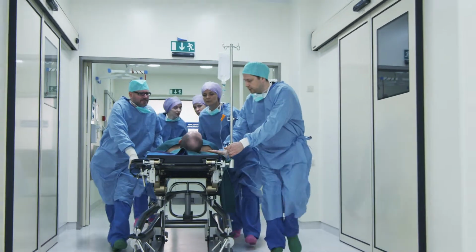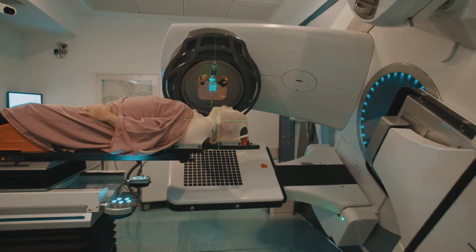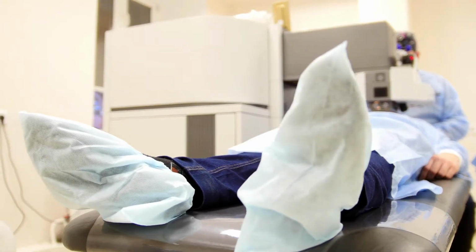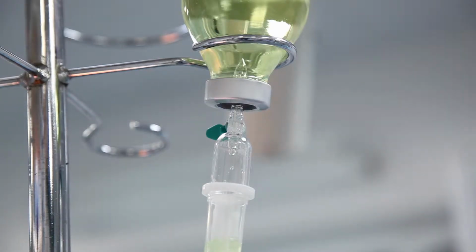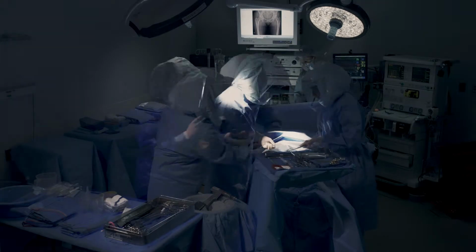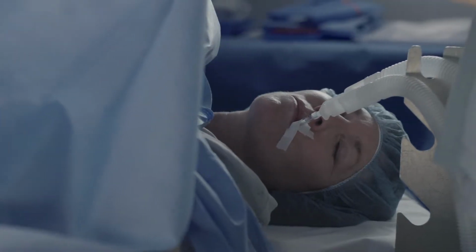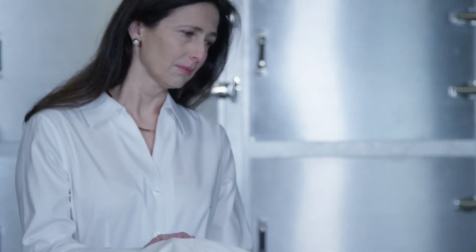Hospital-acquired pressure injuries result from the cumulative effect of exposure to prolonged pressure and can occur across the acute care continuum. During the course of care, a patient may spend hours on a stretcher in the emergency department, then on the operating room table or interventional radiology table. These settings are places where many hospital-acquired pressure injuries begin and are frequently not observed until the patient reaches the intensive care unit.